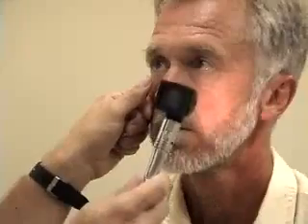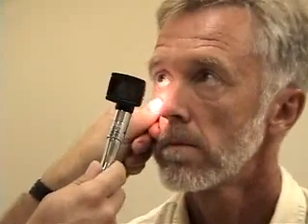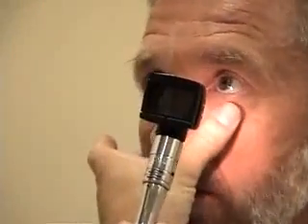All right. Next, we'll move to the eye exam. I'm going to start by having you look just right at my nose, please. I'm going to lower the lower lid so I can inspect the conjunctiva. Okay. And I'm going to turn the light up next to look for his pupillary reflexes, looking right at my nose. I'm going to look both for the direct and the consensual response here, and do the same thing on the other side.